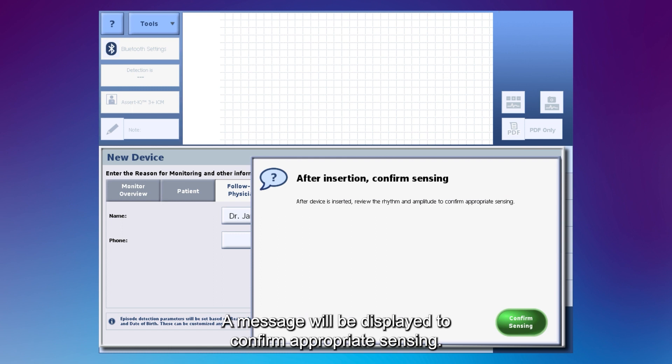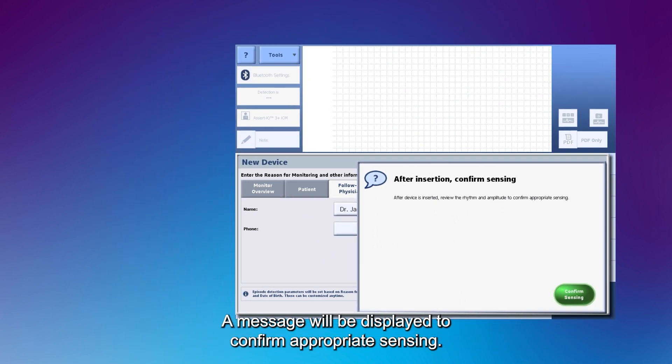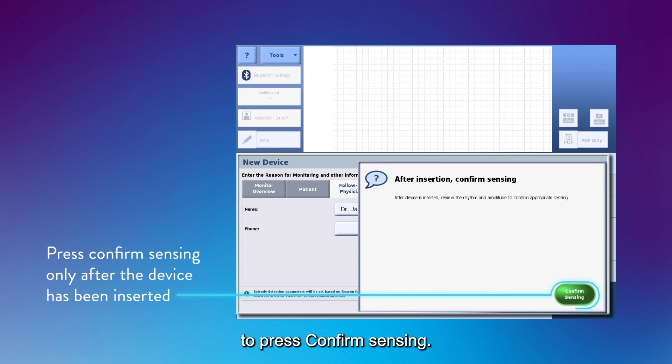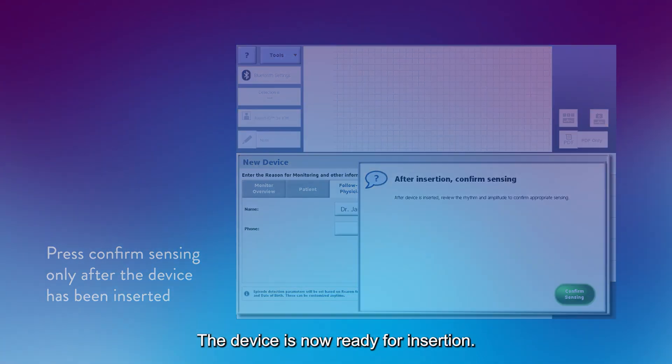A message will be displayed to confirm appropriate sensing. Wait until after the ICM has been inserted to press Confirm Sensing. The device is now ready for insertion.